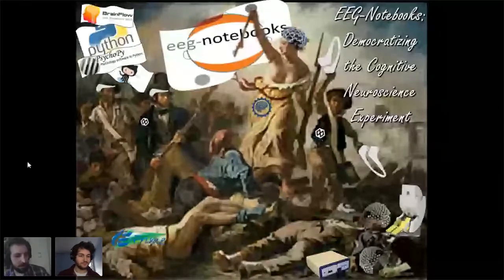Okay, I'll crack on. Welcome everyone to the afternoon session. The plan for the next 1.5 hours is for me to tell you some fun things about this project that I've been involved in for a while. By the way, the enigmatic and exciting figure that you're seeing right now will be explained later on if it's not super clear already. This is going to be an introduction to EEG notebooks.